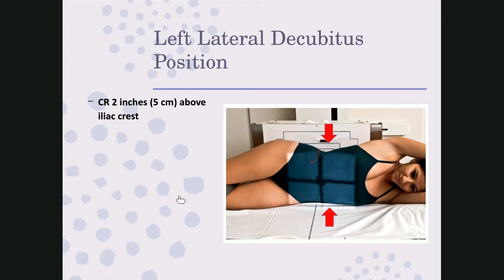Now, our technique for this is going to be 80 kVp at 12.5 mAs, which is a little bit more than our AP supine abdomen. But now, when the patient lies on their side, gravity is not going to really help you because all the tissue is still going to remain on the patient.